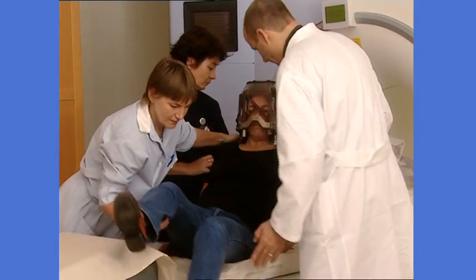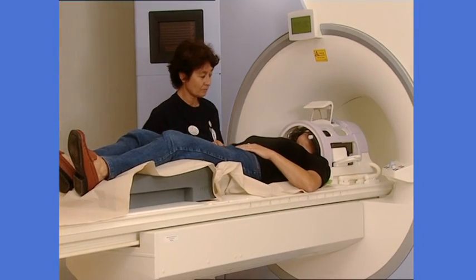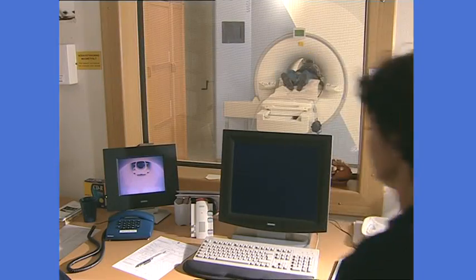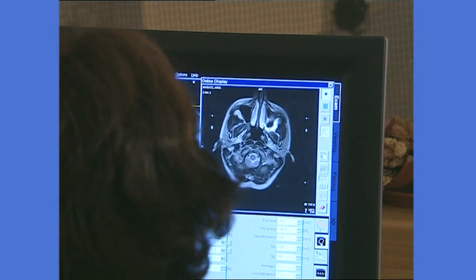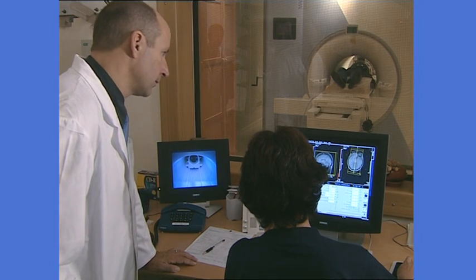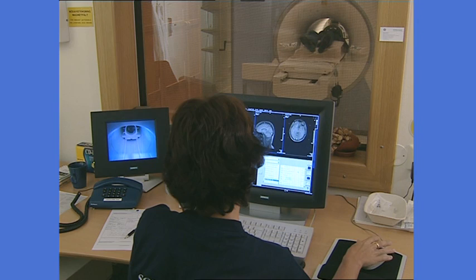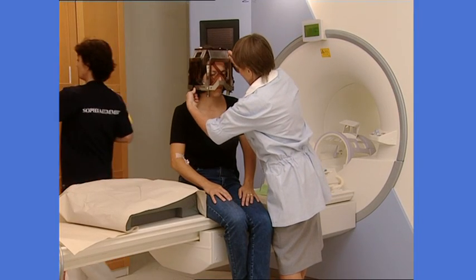A coordinate box is used during imaging to provide reference points on the images for the treatment plan. After the head frame is in place, it's time for imaging — for example, MRI, CT, or angiography. Although these imaging studies may have been done before, they need to be done again with the frame on, to determine the exact location, size, and shape of the target. After imaging, the coordinate box is removed.